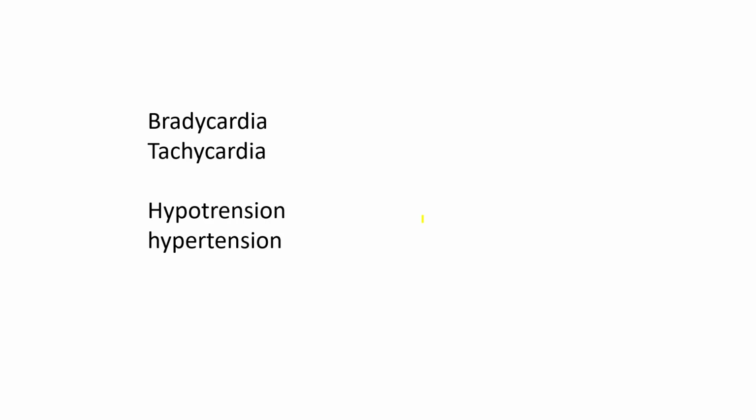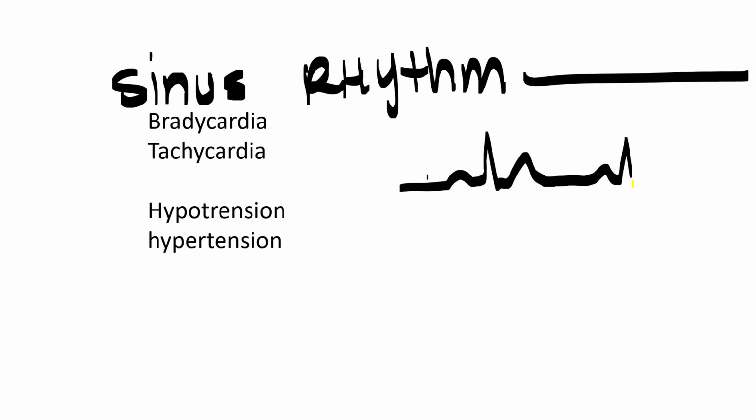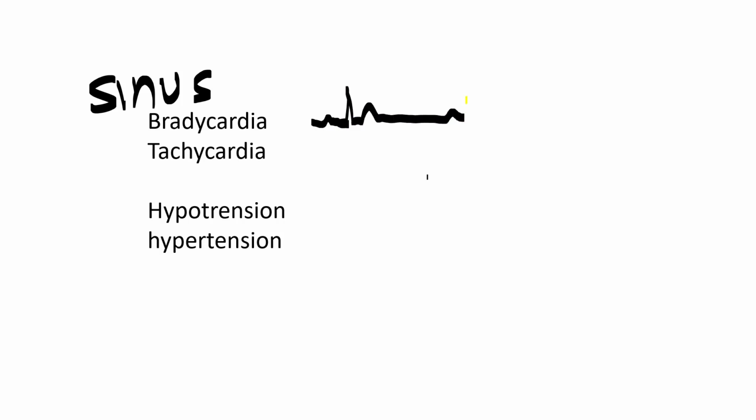So that can be some type of heart block that involves the connection between the ventricles and the atria. I just wanted to point out that normally you'll call a normal rhythm normal sinus rhythm or sinus rhythm. And then if the heart is beating too slow, but it's the SA node that's pacing it, that would be sinus bradycardia. A slow heart rate, but still physiologic, regulated by the SA node. Again, you'd see those QRSs spreading out. You could do your trick with determining heart rate.